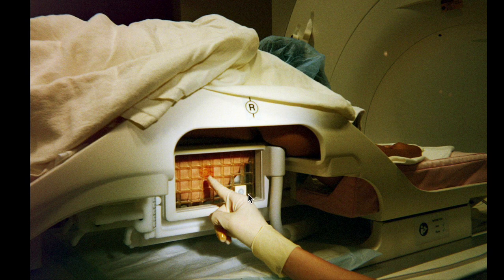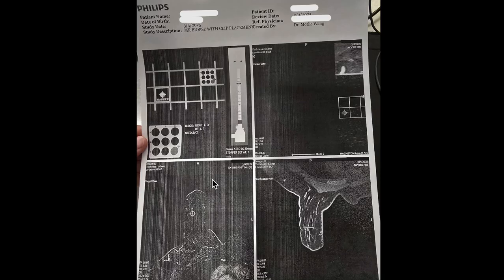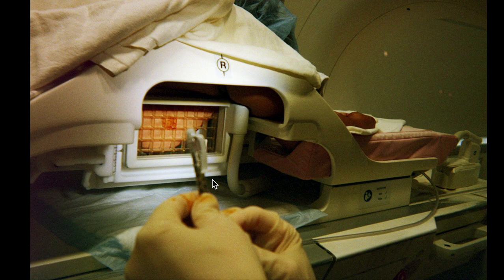If I were to use the other paper that you saw, I think in that image, this fiducial would be probably right over here. But anyway, I have an example of a paper from one patient and an actual biopsy from another patient. So if you could mentally move this, I think right here, then that would match the paper. But anyway, I know this is where I'm going to be working, so I clean that off with 3 swabs of betadine. And I always keep checking, am I in the right place?